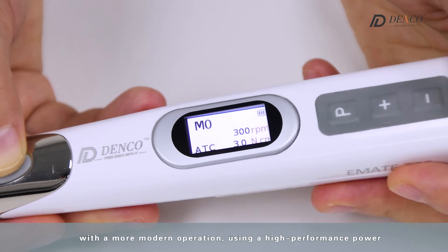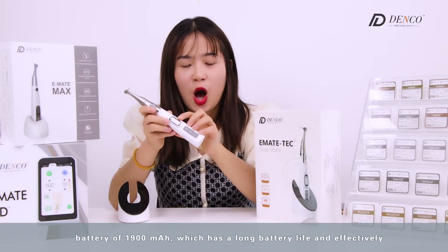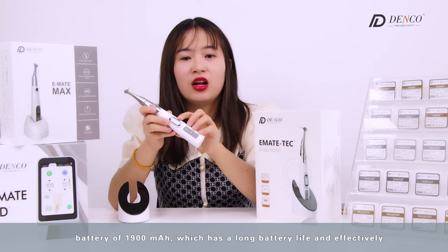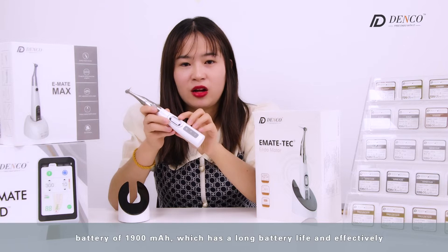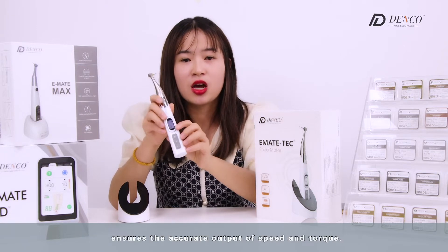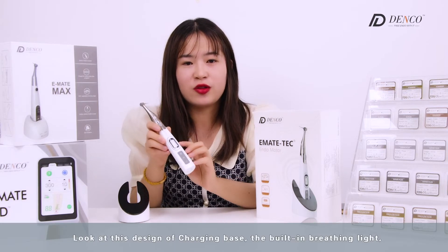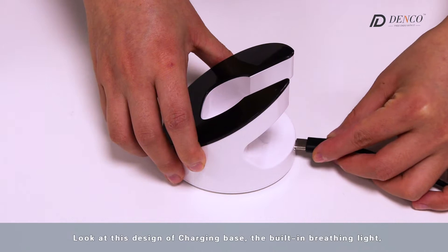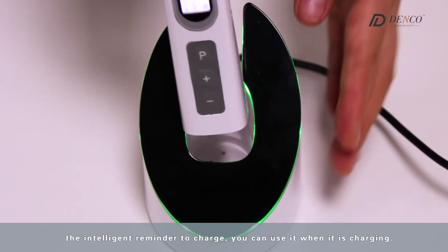With a more modern operation using a high-performance powered battery of 1,900 mAh, it has a long battery life and effectively ensures the accurate output of speed and torque. Look at the design of the charging device — the built-in bracket and the intelligent reminder of the charger.